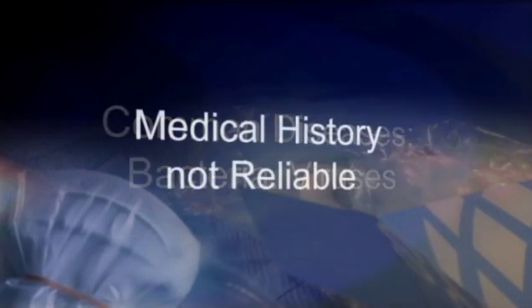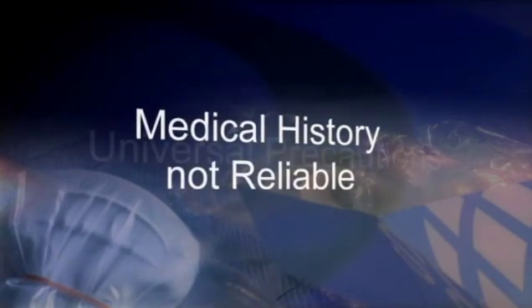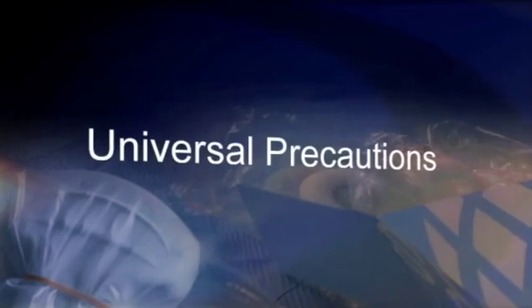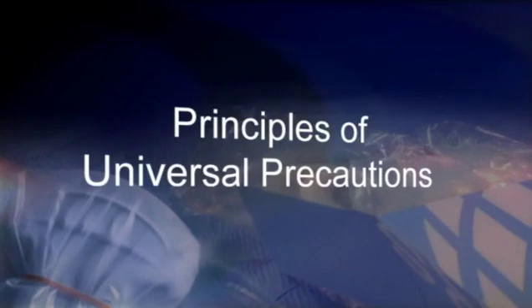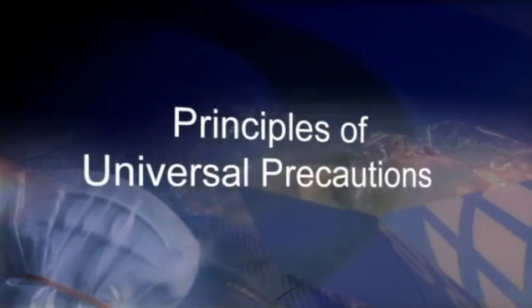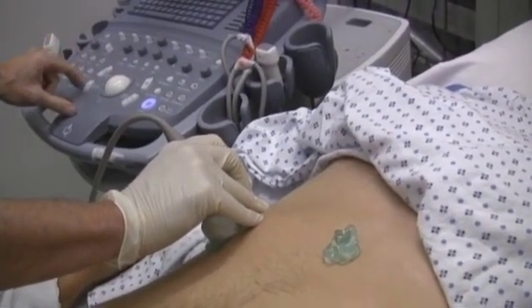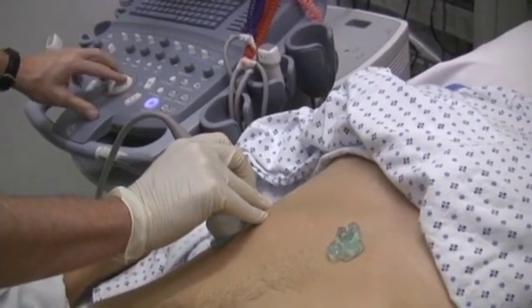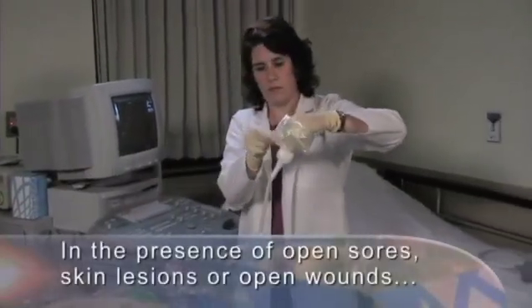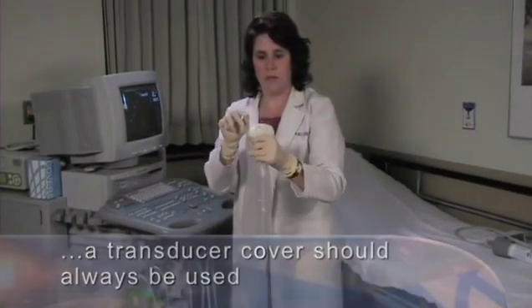The patient's medical history may not present the healthcare worker with a full picture. Therefore, we follow what is called universal precautions. The principle of universal precautions is to treat every patient as if he or she has a communicable disease. For non-invasive studies on unbroken skin, transducer covers are not typically used unless there is the potential for contamination with blood or body fluids. However, in the presence of open sores, skin lesions, or open wounds, a transducer cover should always be used.